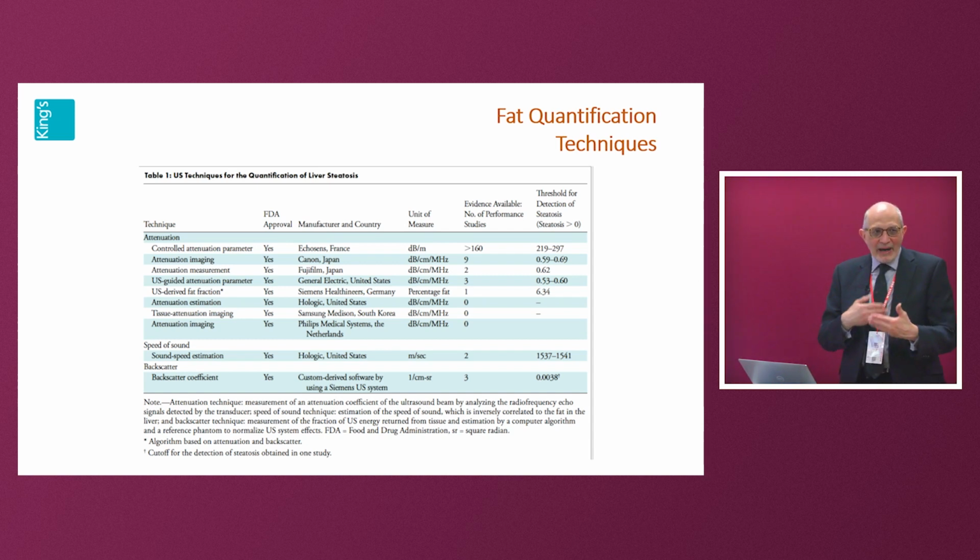You can see now why I'm saying don't hold your breath with all of this. It's going to evolve and settle down over the next couple of years. Personally, I think, and for the patient, a fat fraction measurement in percentage terms is the most useful. And this needs to be validated clinically as well.